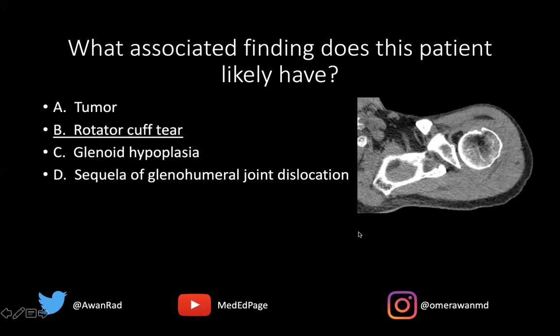So the best answer here is a rotator cuff tear. This finding of a bursal lipohematoma is associated with a rotator cuff tear — more specifically a full thickness rotator cuff tear. It has nothing to do with a tumor. There's no evidence of glenoid hypoplasia; the glenoid looks pretty well formed. And this certainly doesn't look like glenohumeral joint dislocation — I don't see a Hill-Sachs defect or a Bankart lesion along the anterior inferior glenoid.